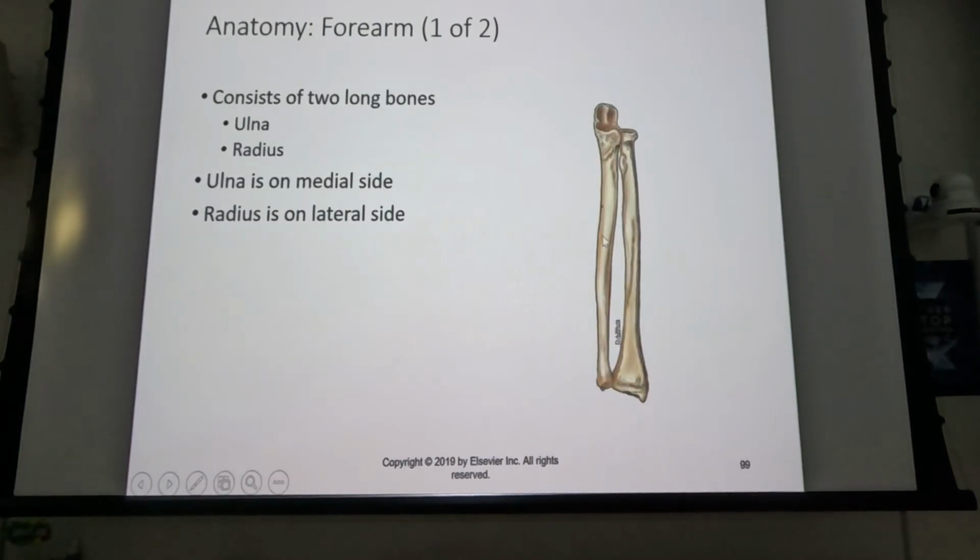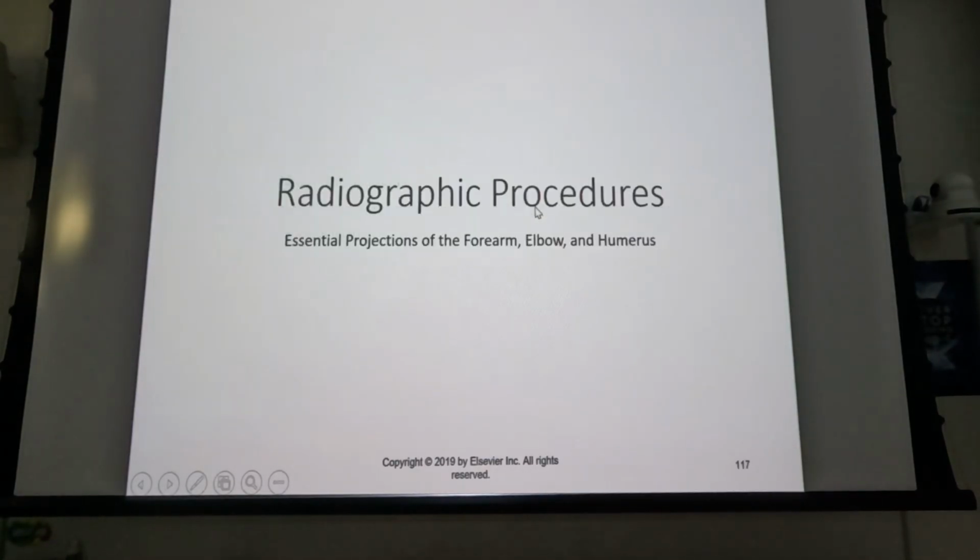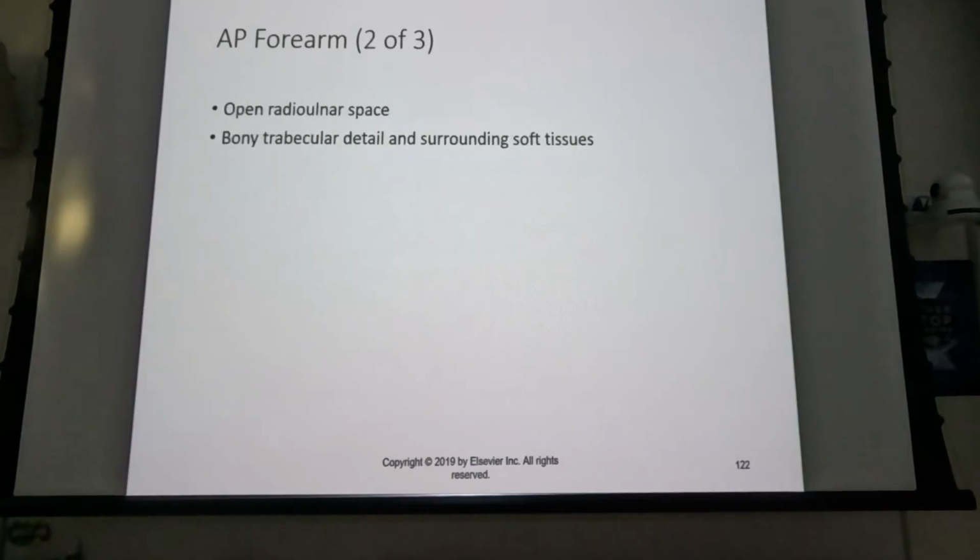So if you've got fractures across both of those, and then you try to start rotating them around, then the bones can start grinding on each other. They can pinch soft tissue. It's just a bad situation, right? So certainly ask the patient, but if they show any kind of hesitance, you're just going to shoot it as it is. Okay?